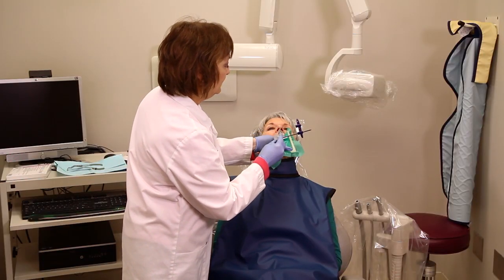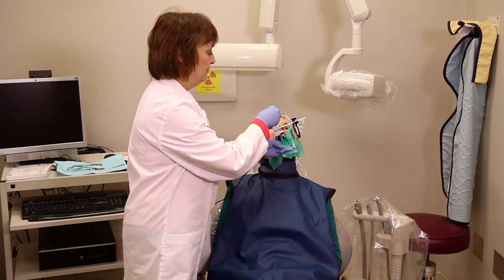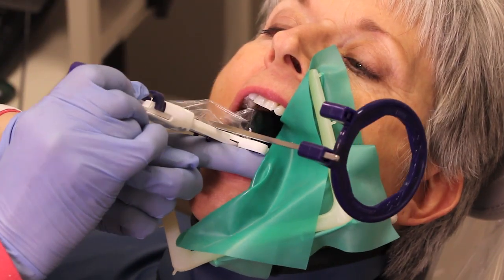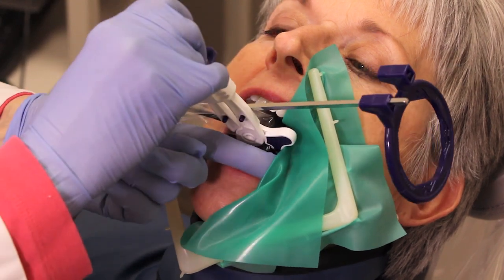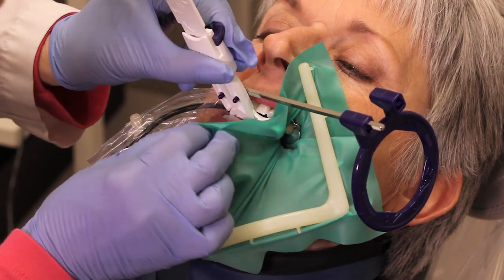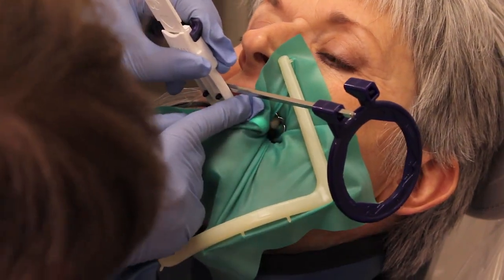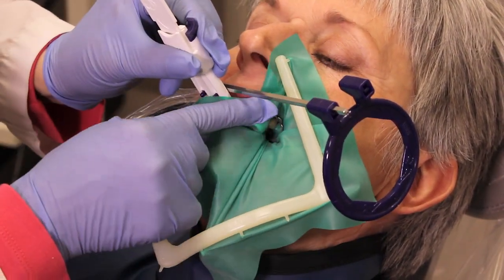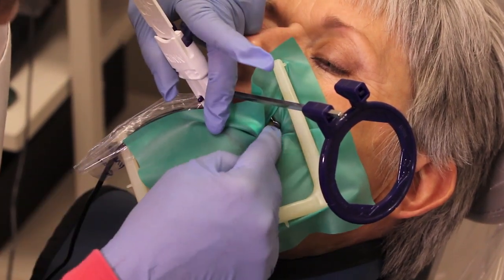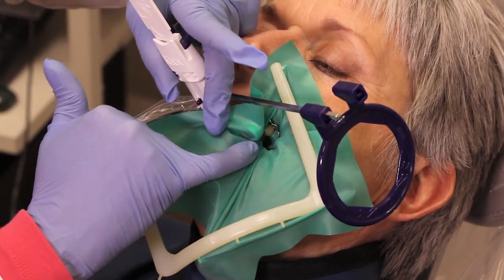Slide it in behind the tooth through the rubber dam, and once you get that in there, you can actually pull it back to make sure that you have it in far enough to accommodate the tooth. You can see there's the tooth and there's plenty of room for the file — it won't be hitting anything.